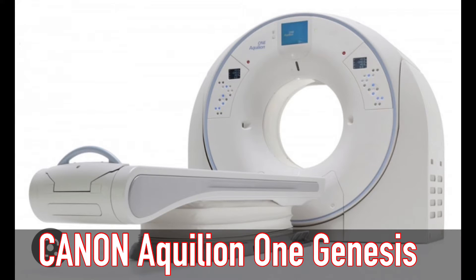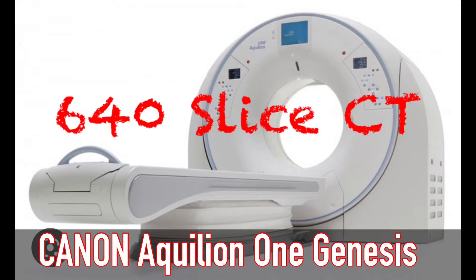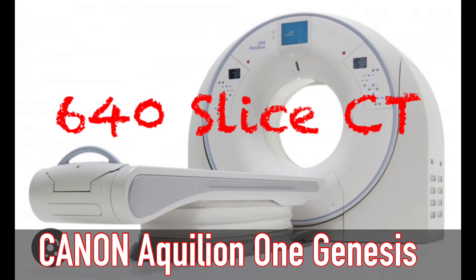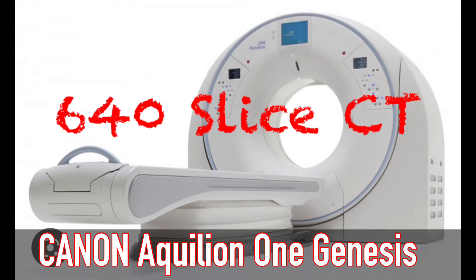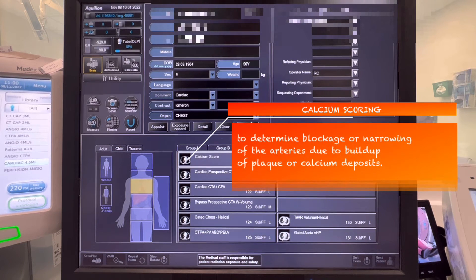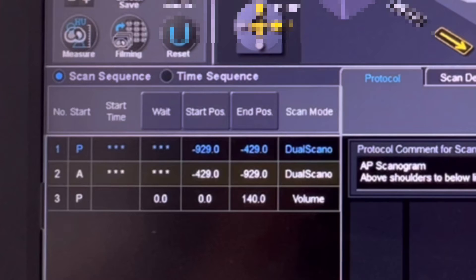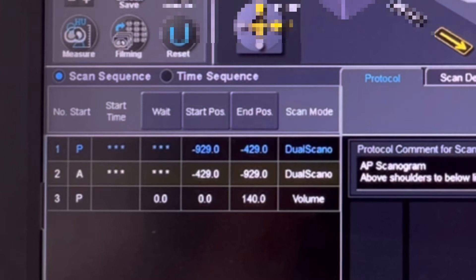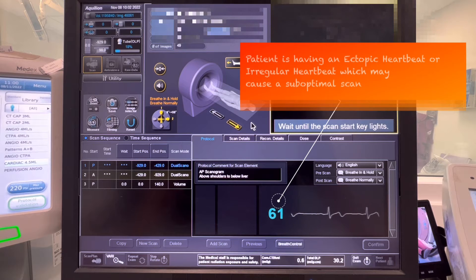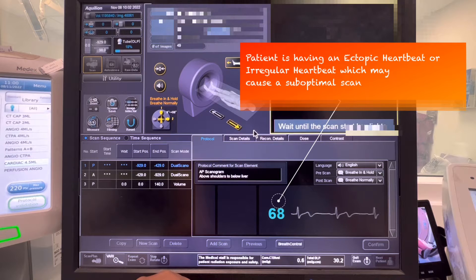We are going to use our Canon Aquilion 1 Genesis 640-slice CT. This machine is great for scanning cardiac cases due to its large detector size and speed, which can acquire higher radiographic images of the heart at whatever heart rate a patient has. Let's begin by choosing the calcium scoring protocol to determine blockage or narrowing of the arteries due to buildup of plaque or calcium deposits. This is our protocol for the calcium scoring. Our patient is having an ectopic or irregular heartbeat, which may cause a suboptimal scan.